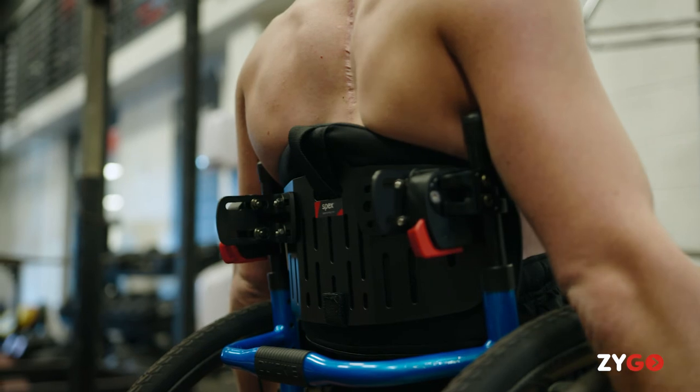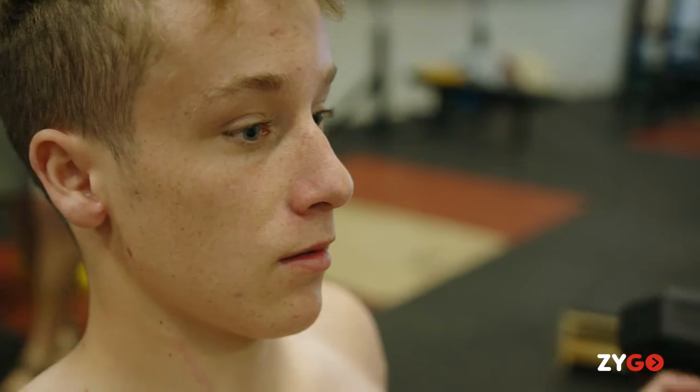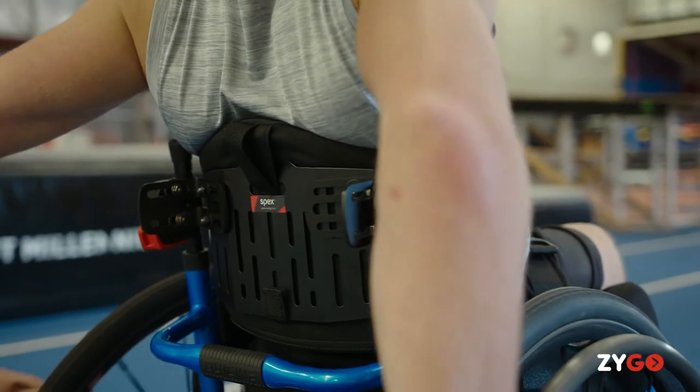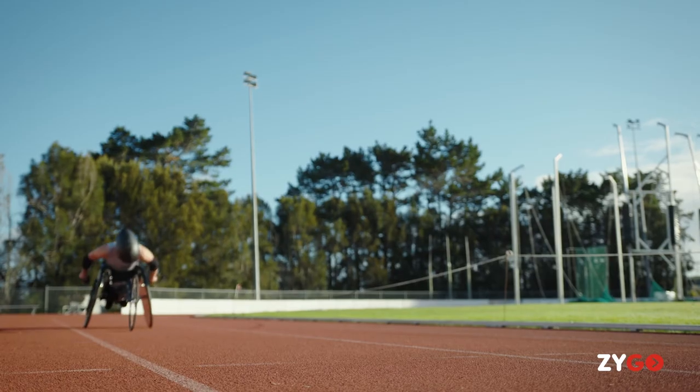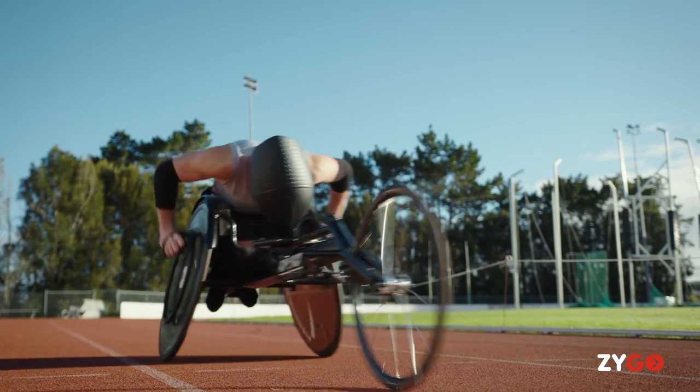Zygo back support systems give you more comfort, flexibility, personalisation, and freedom to move — enabling you to go places, achieve more, and be who you want to be. With Zygo you can go for it. Go you!